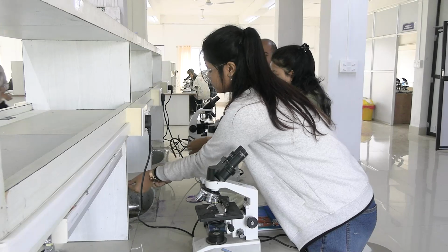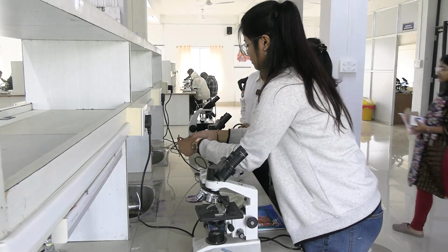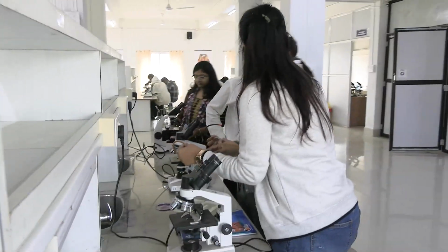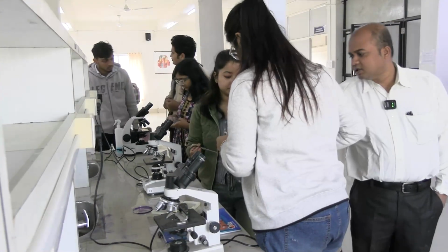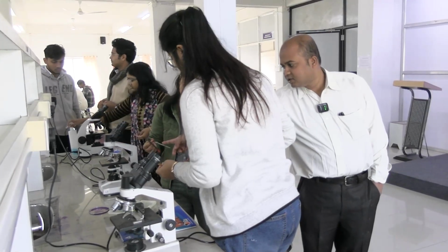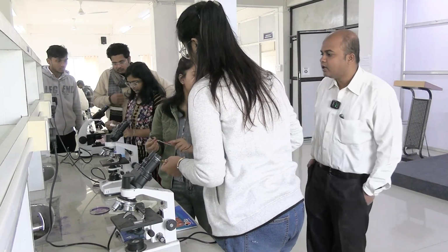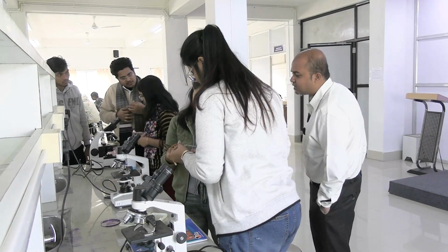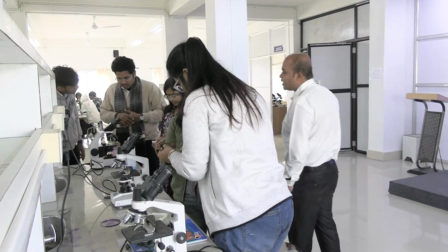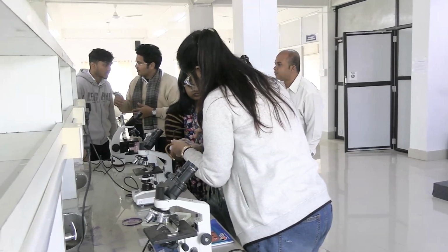How do you differentiate between the RBC pipette and the WBC pipette? Only the color? The color may fade away. Even this is not easy to fade away. These are relatively new instruments. In older instruments, see the markings and the size of the bulb. Compare the size of the bulb, and the markings, you see 101, 11.